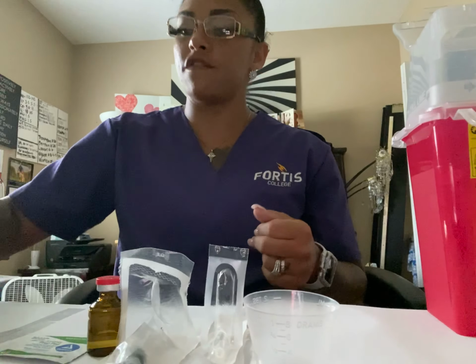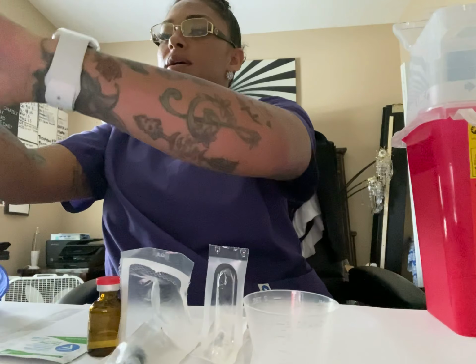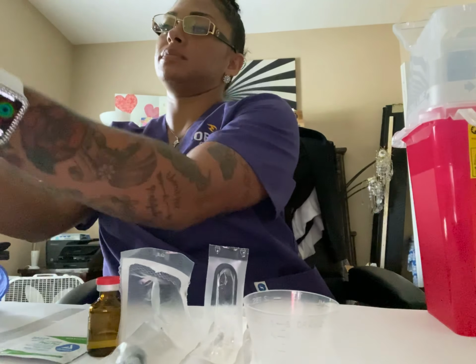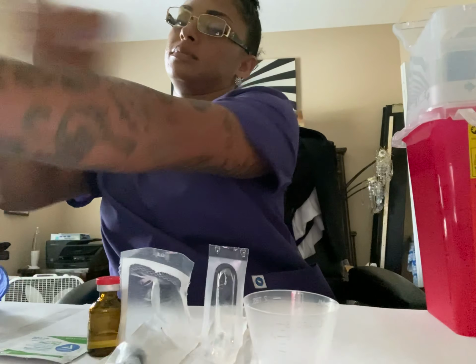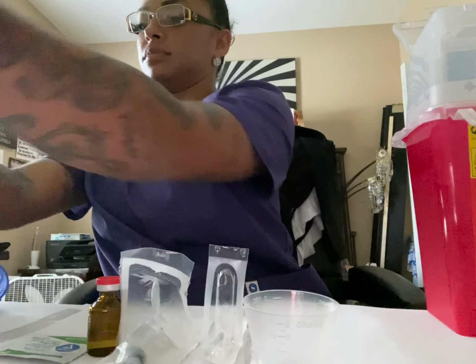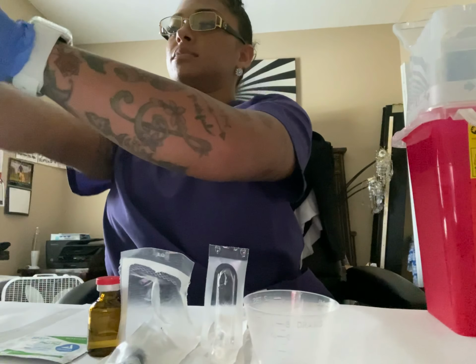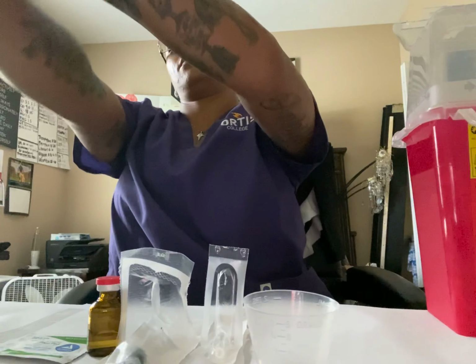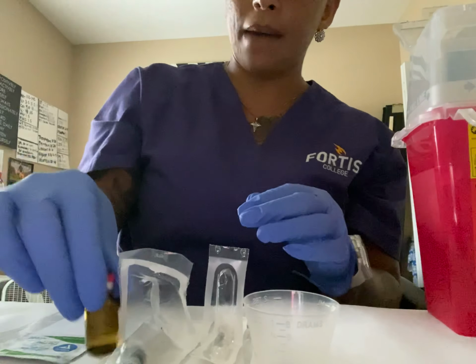And then we're going to go ahead and perform hand hygiene, and we will glove up. So the first thing I'm going to do after putting my gloves on is remove the cap from the vial.